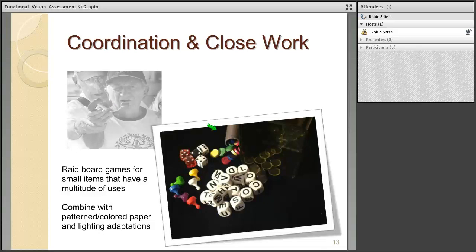These right here are chips from Parcheesi. They're about the size of a dime, and you can see their thickness. These chips are actually wooden, but everything else you see here is plastic and washable. I haven't thought of a use for these translucent yellow chips yet, but I like the feel of them, and their amber tone may actually have a use in glare or contrast tasks.